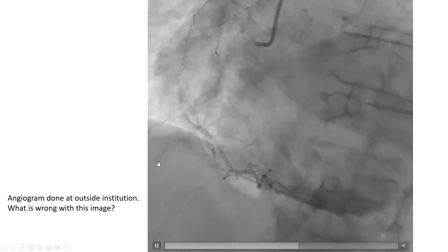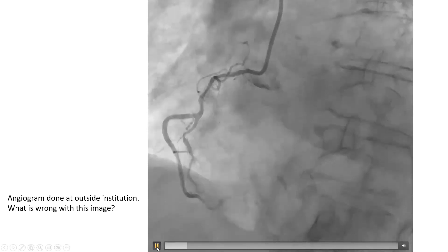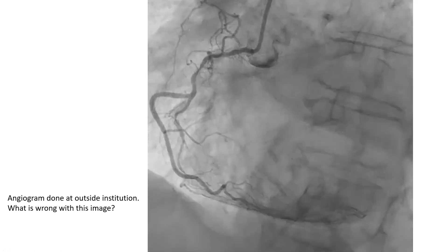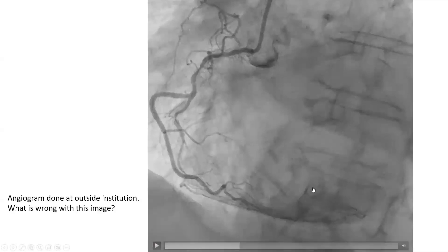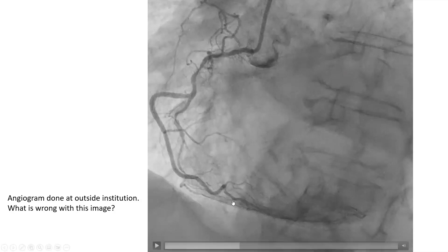There are three steps here: one, you are occlusive with your catheter and get damping or ventricularization; two, you get dye stain in the vessel and in the myocardium; and three — what will happen after myocardial stain in the next few seconds if you don't disengage your catheter? Ventricular fibrillation. That's why when you see this, you jump on the catheter and pull it out — you have one or two seconds before the patient goes into V-fib.